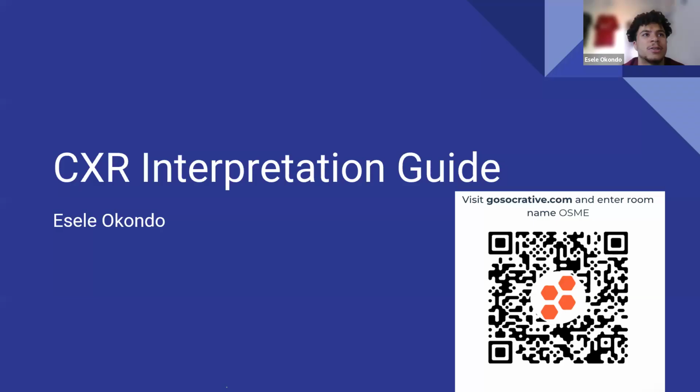So now we'll move on to interpreting chest x-rays. So I'll give you another chance for any of you guys to join the Socrative who haven't already. And we've got two questions on that. Firstly, why would a chest x-ray be needed? What's the point in a chest x-ray? Why do we do it?